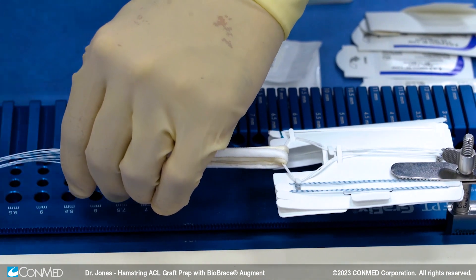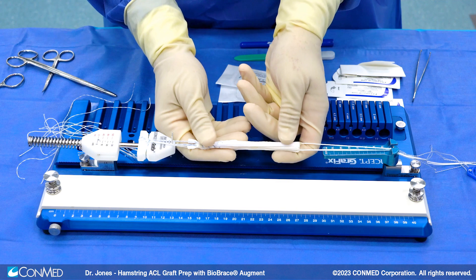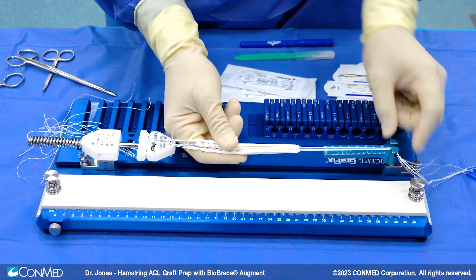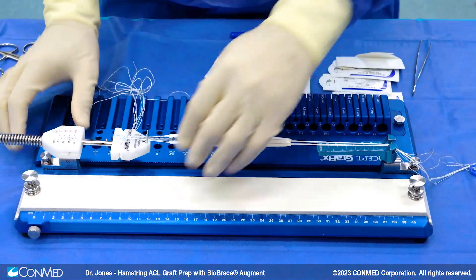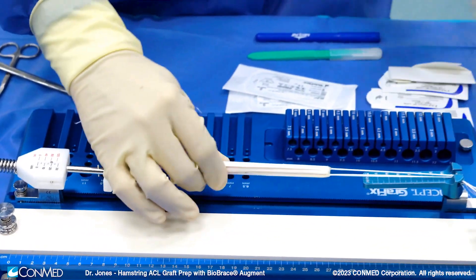The blood flow will go toward the biobrace instead of being blocked by the allograft itself. We've placed our button for proximal fixation; distally we have a tensioning device, the GraphFix, that will allow us to tension. Now we're at 20 pounds of tension — that seems pretty good, tensioning all four limbs equally — and this is going to prevent any creep.